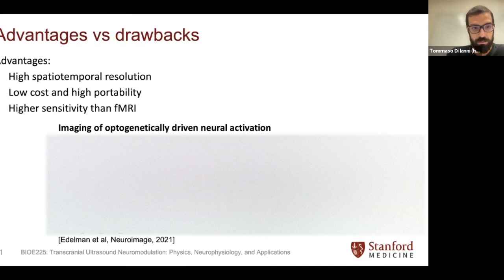Going back to the hemodynamic difference between the two, the signals that we receive are not necessarily indicative of what's better or not. The hemodynamic response function is actually pretty different. In the case of fMRI, and this is a known thing I believe, Kim, correct me if I'm wrong, fMRI goes up and then you have a rebound period after the activation, while functional ultrasound stays above baseline. Yeah, and so I think that's just a difference. But the difference here is looking at cerebral blood flow versus volume. But I could be wrong. I'm not sure about that.